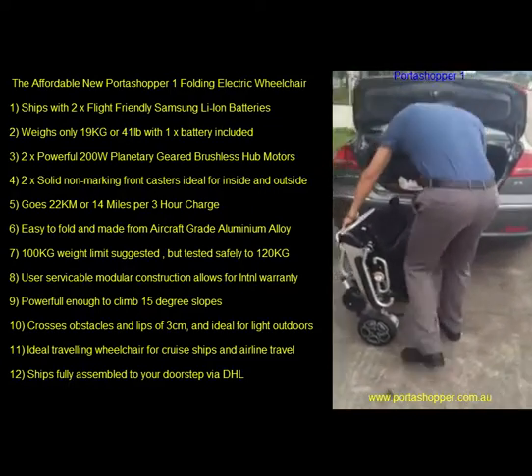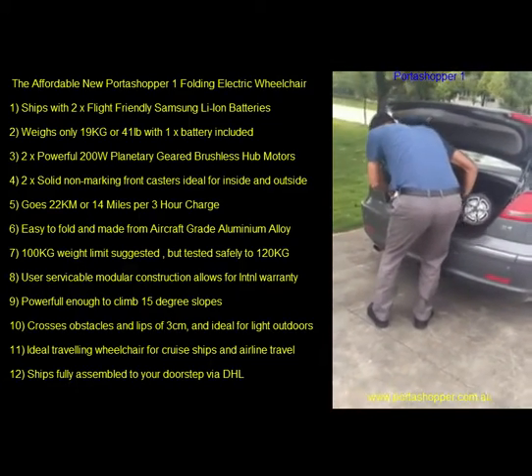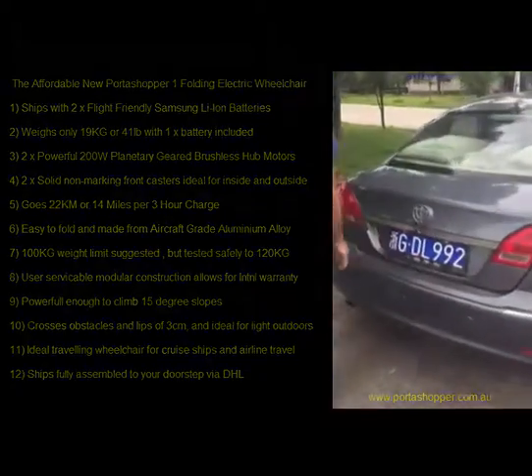The wheelchair only weighs 19kg and that's with one battery included, so should be easy for anybody with normal upper body strength to put this into the car's boot. Thank you very much.